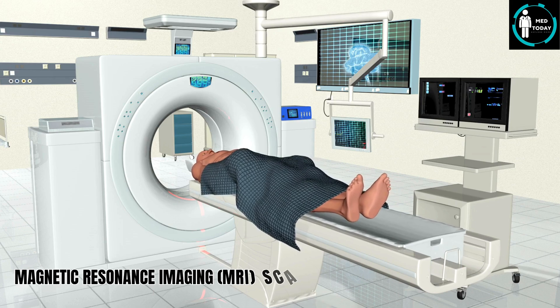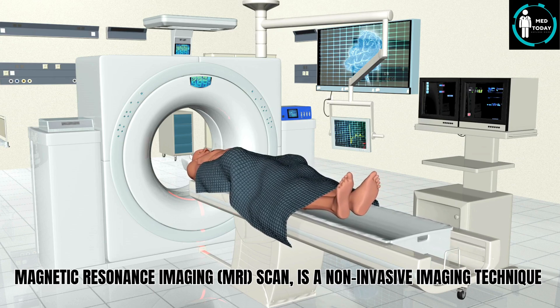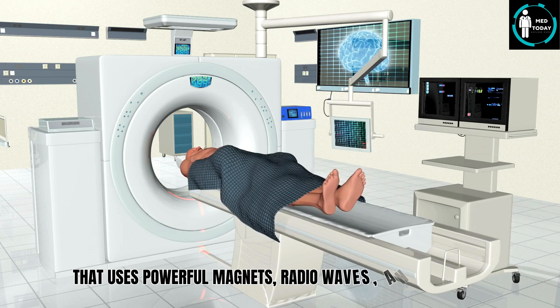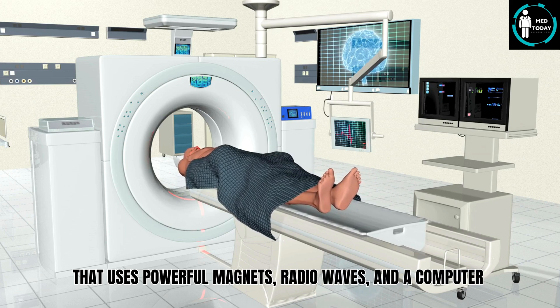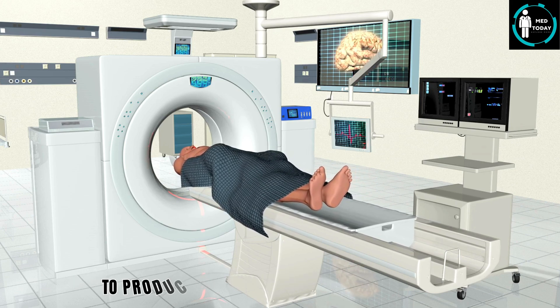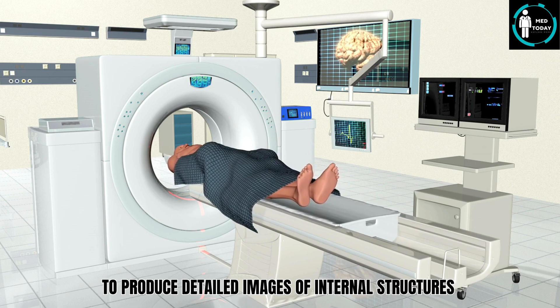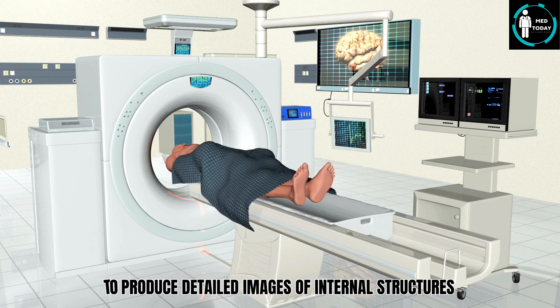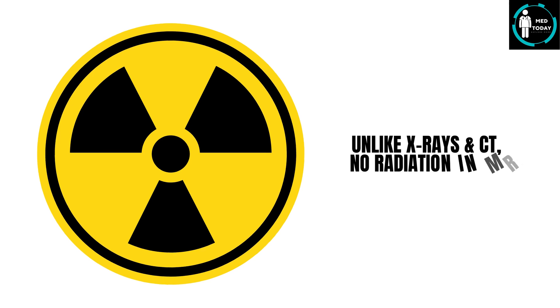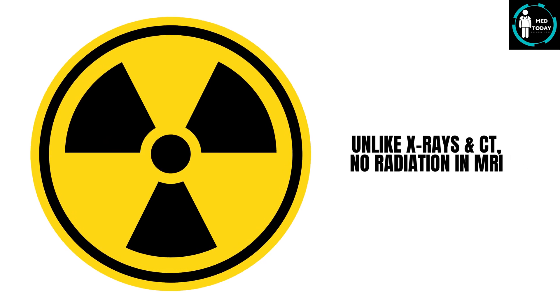Magnetic resonance imaging, or MRI scan, is a non-invasive imaging technique that uses powerful magnets, radio waves, and a computer to produce detailed images of internal structures, especially soft tissues. Unlike x-rays and CT scans, MRI does not use ionizing radiation.